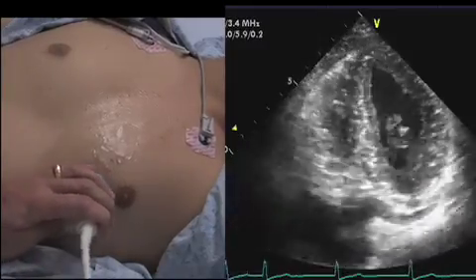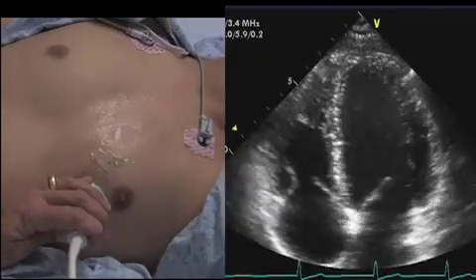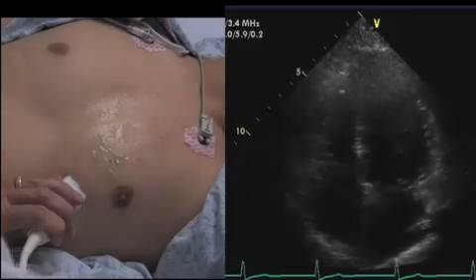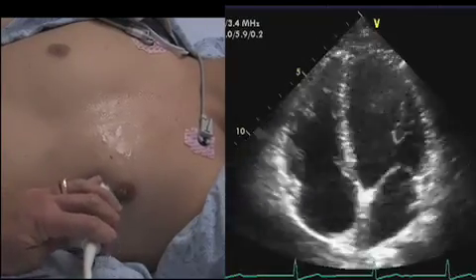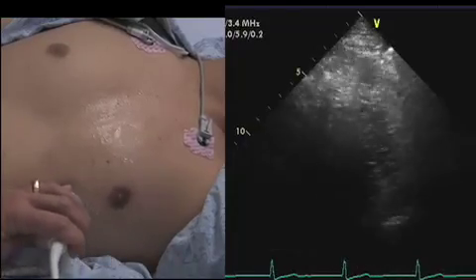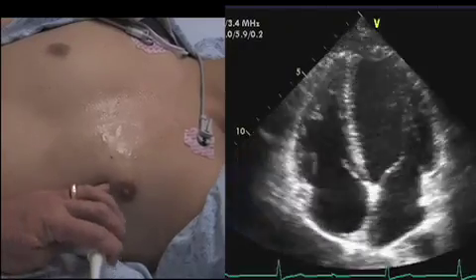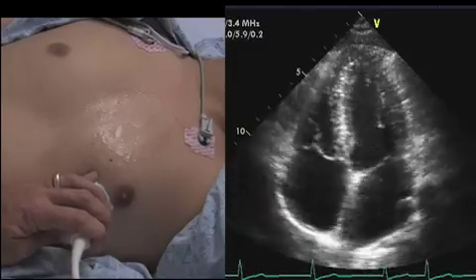Now I can make more minute manipulations to fine-tune an image. It's very easy to end up in a place where you're working and working and it's not a good window. If you just take a little circle survey or go window shopping, you may stumble into a better view, and because you're always moving in that predictable circular manner it's very easy to get back to where you were. So that's the circle survey — let's go window shopping and have better images every day.